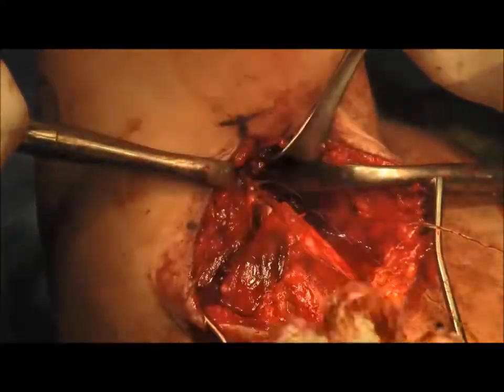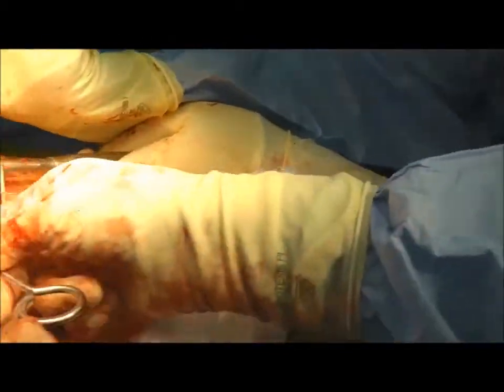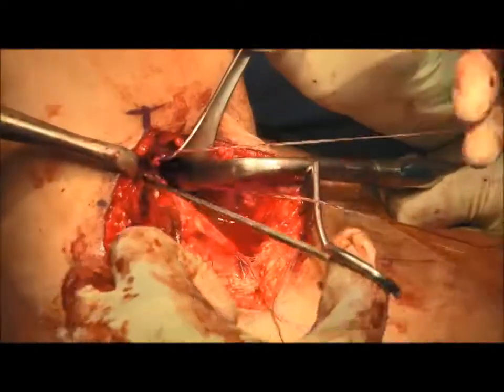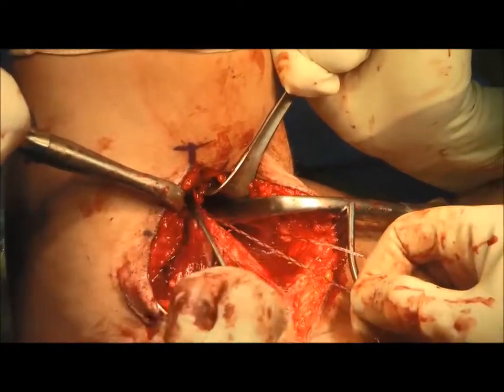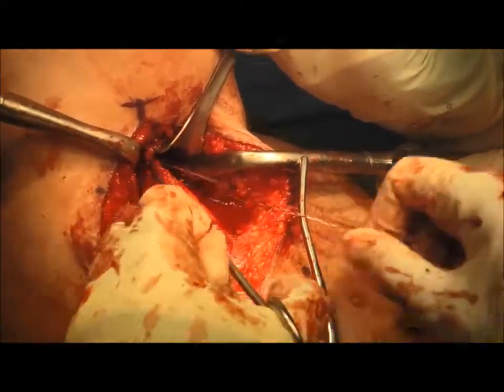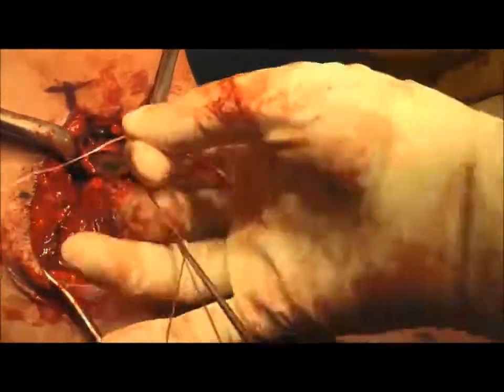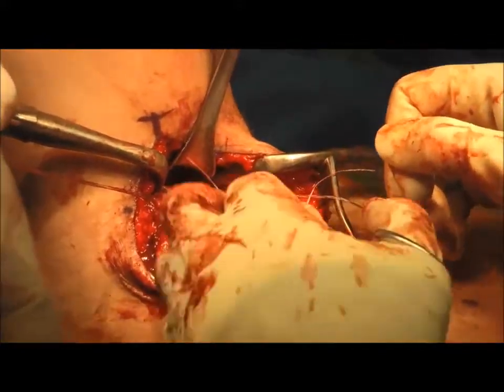Once the sutures are passed, they are tensioned, keeping in mind which strands are the post-strands, as the tendon is reduced and suture tying is performed. An arthroscopic knot pusher is used to facilitate knot tension deep in the wound. The second set of suture tape is then also tied using the arthroscopic knot pusher.